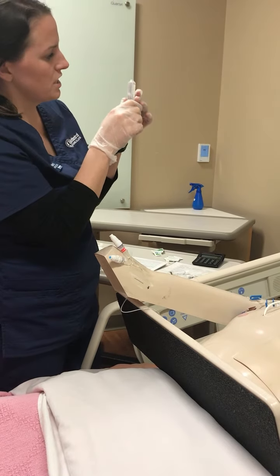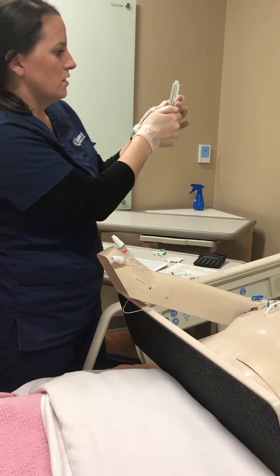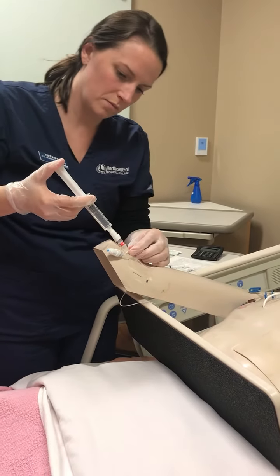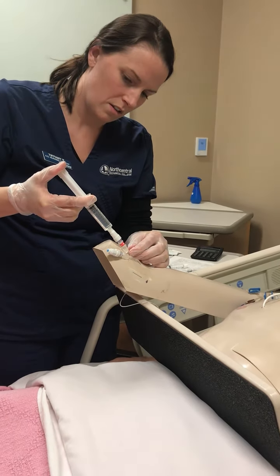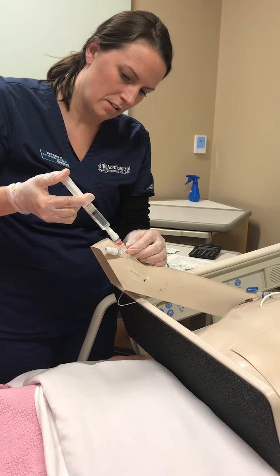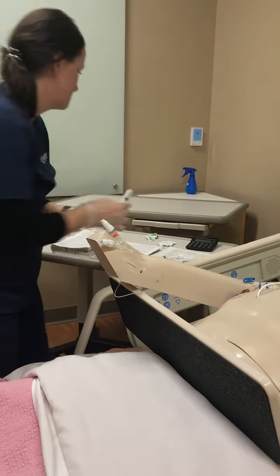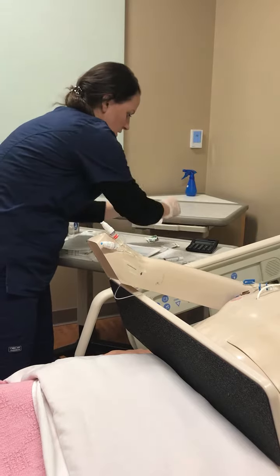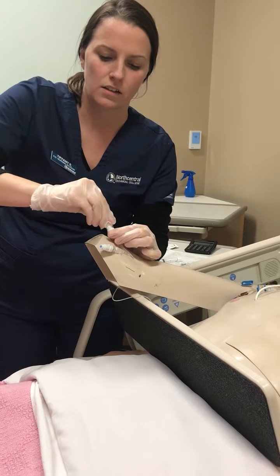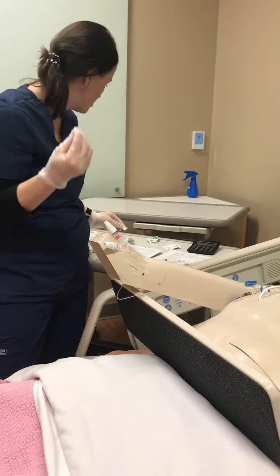It's within the expiration date. No concerns there. Relieve any of the air bubbles there, and I would go ahead and flush with 5 milliliters. Alright. And then I'll go ahead and clean per agency policy, clamping in between when I don't have anything actually attached to it.